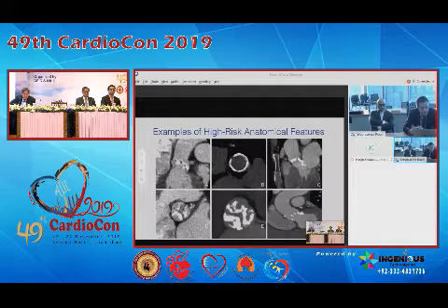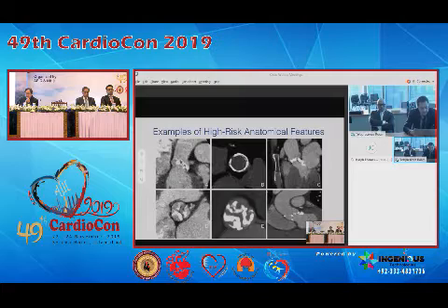Panel B is a very calcified sinotubular junction. Panel E is a bicuspid valve with heavy calcium burden. Panels C and F show LVOT calcium that, if the TAVR valve, especially balloon-expandable valves, can be placed, you'll cause annular rupture, annular disruption. And that also needs to be understood: not all patients who are low risk are candidates for this procedure. You have to put it in the framework of very adequate, very good CT imaging.